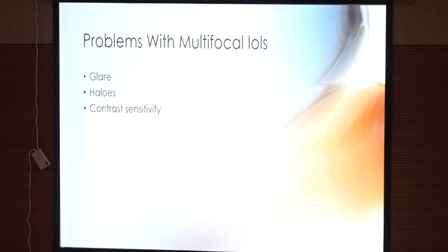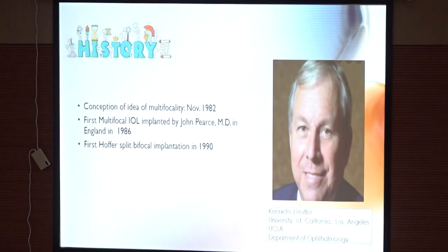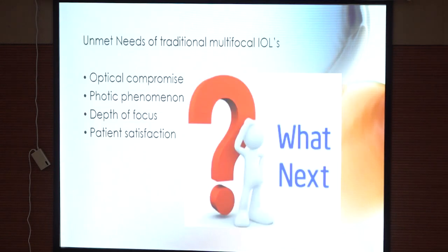So what are the problems with multifocal IOLs? There can be glare, halos, and decreased contrast sensitivity. So the idea of multifocality was given by John Pierce and Hoffer. And what are the unmet needs of traditional multifocal IOLs? They lead to photic phenomena, decreased depth of focus, and poor patient satisfaction.